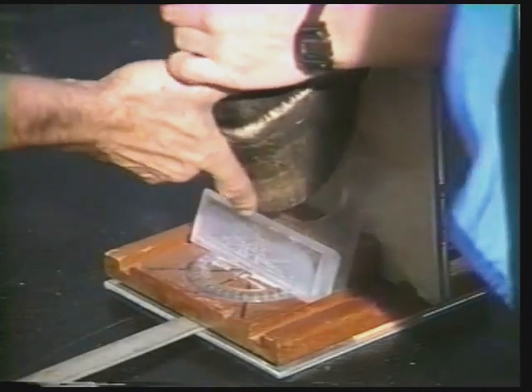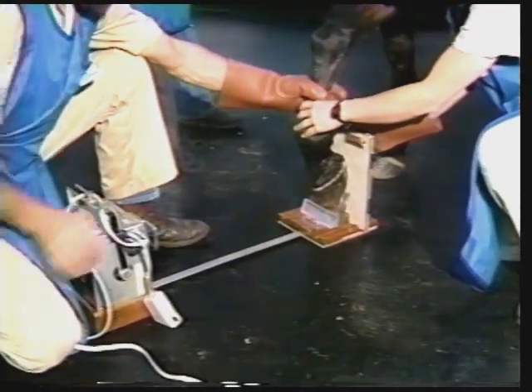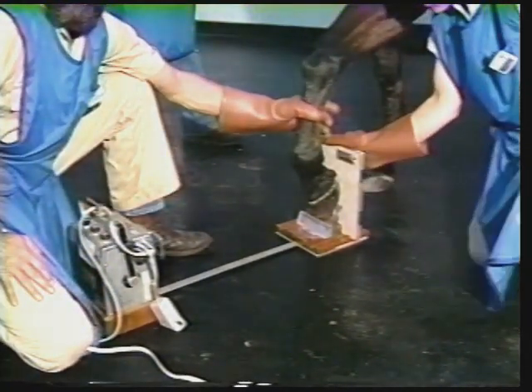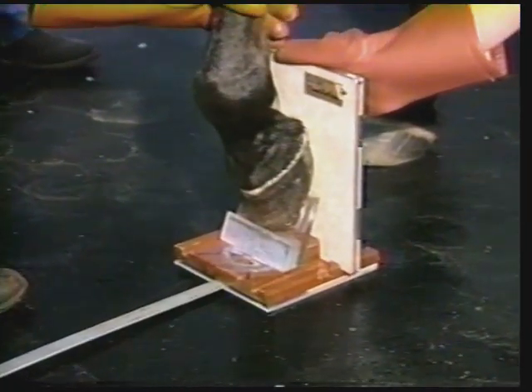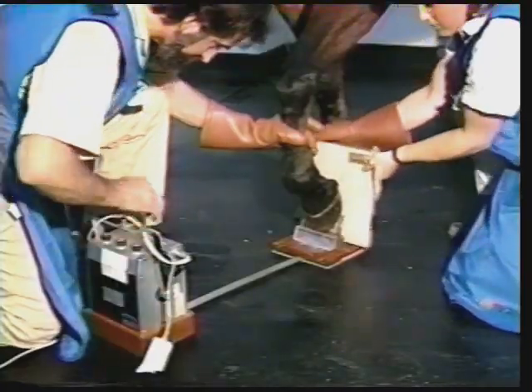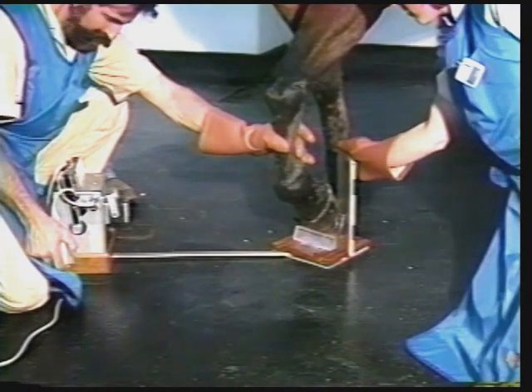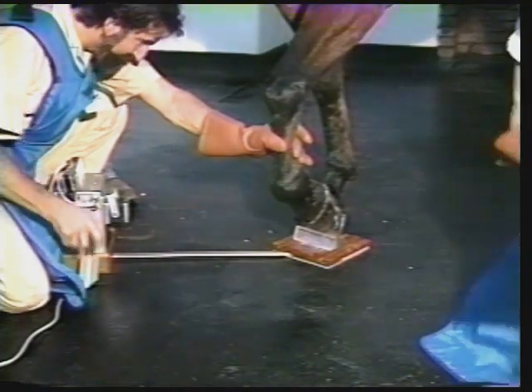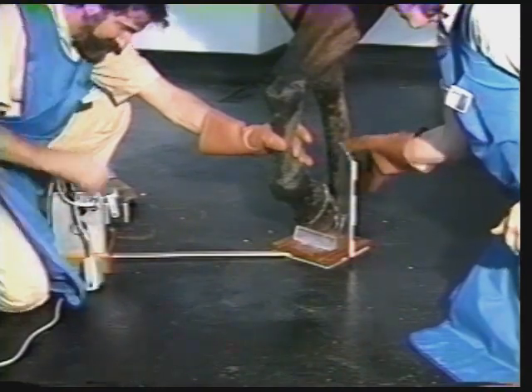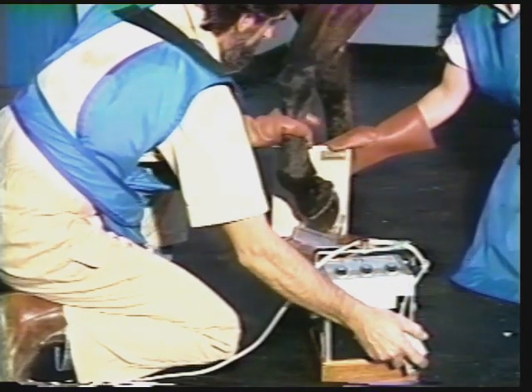I'm now using a device that I designed several years ago that has been on the market off and on for a few years. It's been very difficult to manufacture this positioning device on an economical level due to the handwork that has to go in it. But this particular device allows me two positions, a 65 and a 70-degree angle. That's an angle off the ground surface of the foot to the ground. It allows me a constant fixed distance from beam, from focal point to subject to film. It allows me a consistent way to know exactly the position the foot is in relationship to that beam.